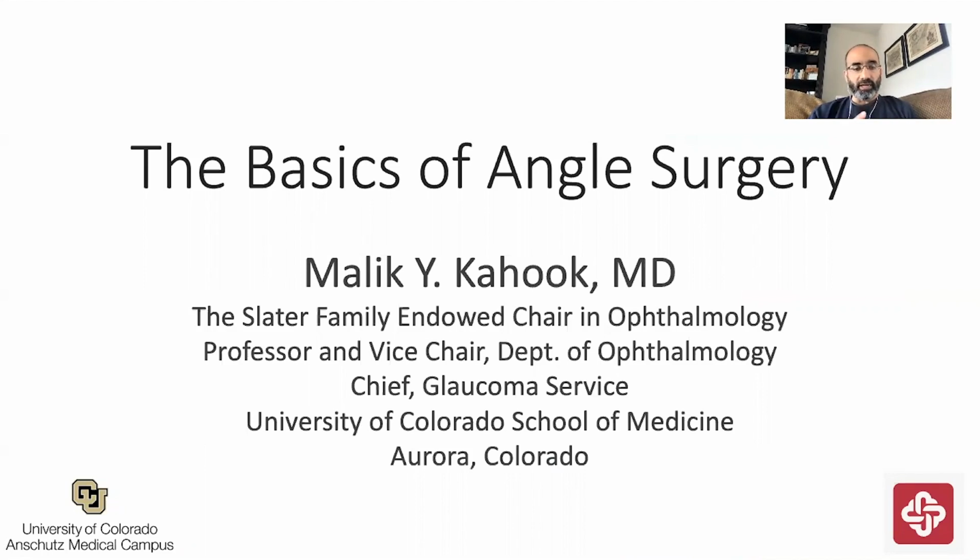What we're going to do today is something that I haven't really seen done before on the CyberSight lecture series. We're going to combine the use of simulation eyes along with real-world surgical procedures so that you can see how things translate from the teaching environment to doing a case from start to end.